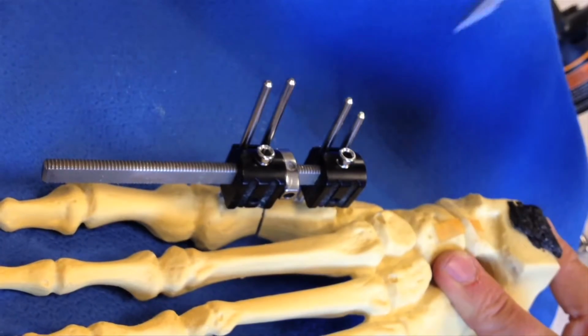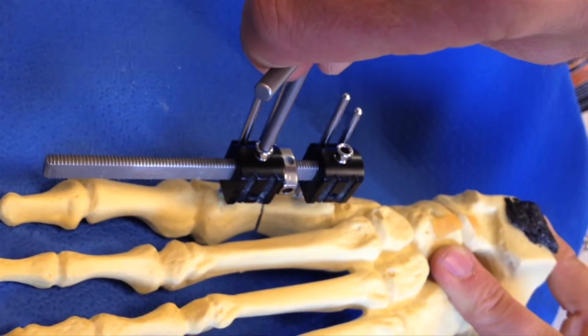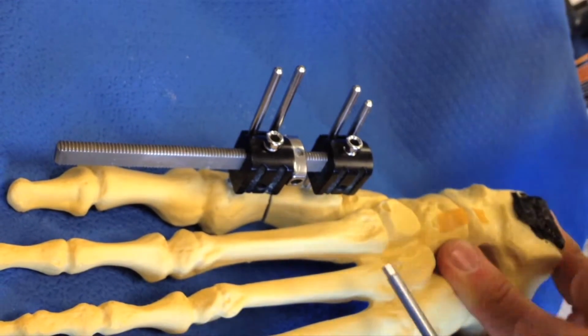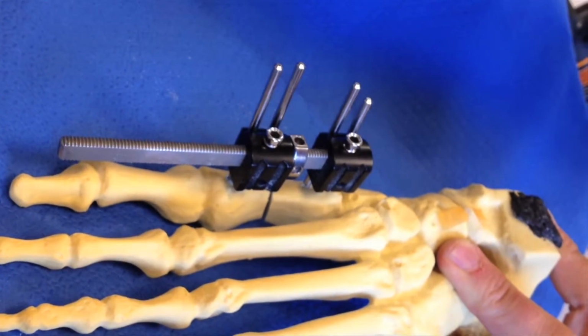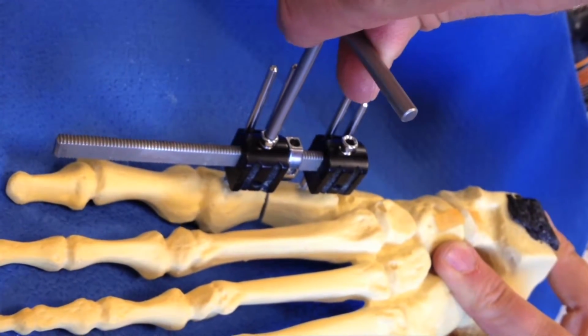First, I'd like to look at a sawbone bone model and show how to do the adjustment on that. We will look at that from a few different angles so that it's very clear how to do this correctly. First, we put the wrench inside the set screw and turn it counterclockwise to loosen it. Then, I put my wrench inside the nut and advance it 1/4 turn. Then, I lock this set screw back up again by turning clockwise.